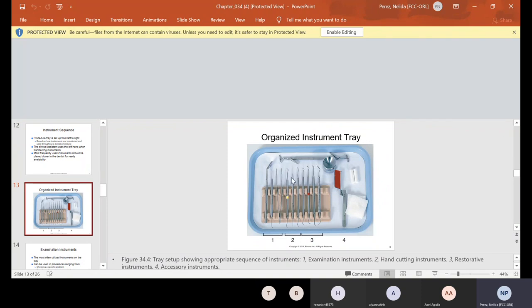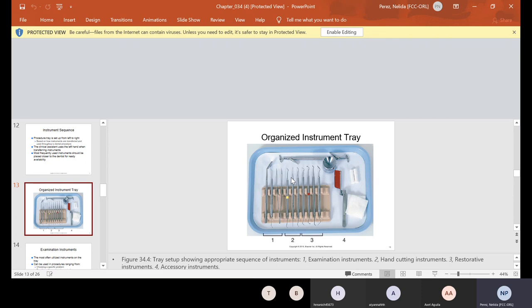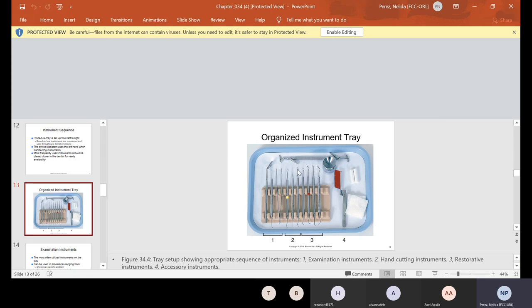Your second set of instruments are hand cutting instruments. They can consist of anything like your chisel, your hatchet, sometimes your spoon excavator is in there also. Then the next set is your restorative. That's what you're going to use to help with the procedure. So here is the amalgam carrier, the articulating holder and paper, cotton rolls, two by two gauze. And usually you have what's called the plugger or condenser, the burnishers, there's many different burnishers. Acorn ball burnisher, the T-ball, the beaver tail. And then comes your carvers, your discoid cleoid carver or your Hollenback.